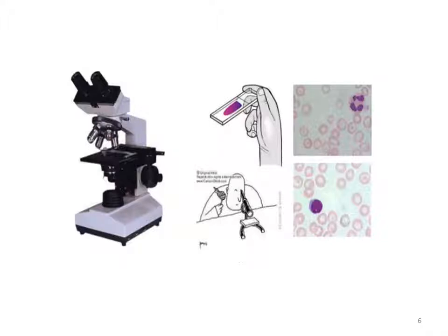The second part of the assessment of the peripheral blood smear is the microscopic assessment. This is where the slide is literally put under the objectives and viewed through the oculars to ensure the quality of the smear and slide is good.